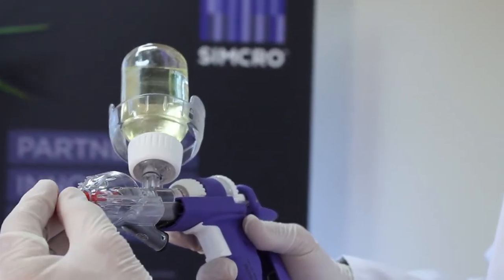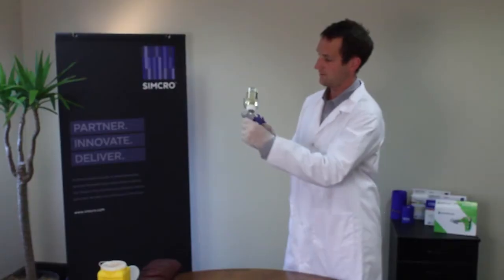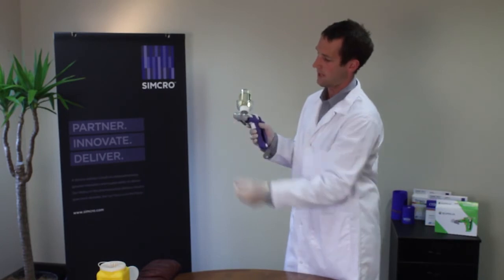To remove the needle again, reverse the process: straight in, half a turn, and out. So needle in, half turn, and out.